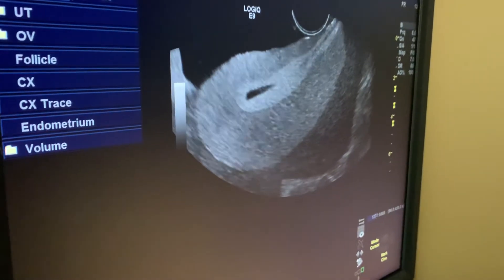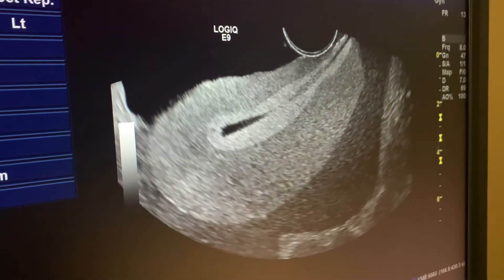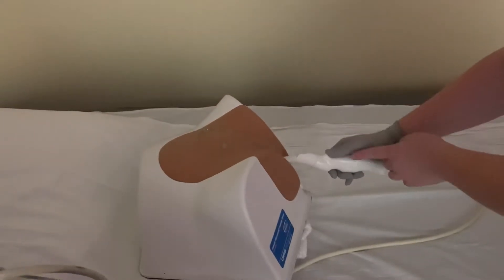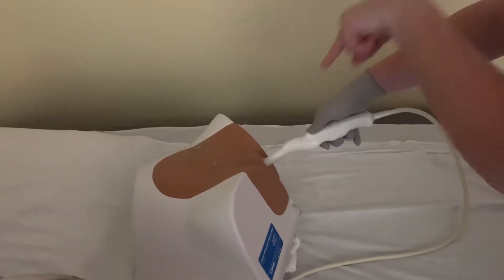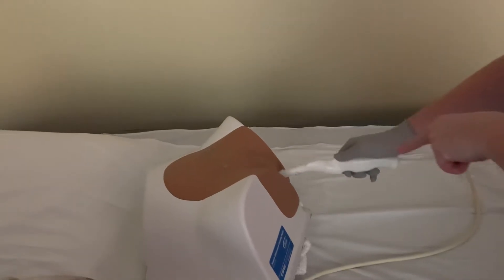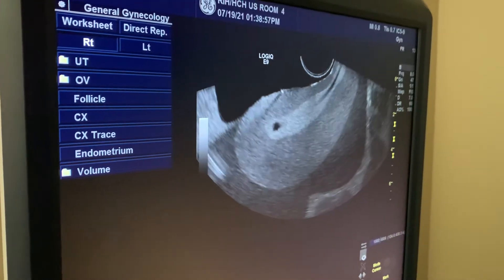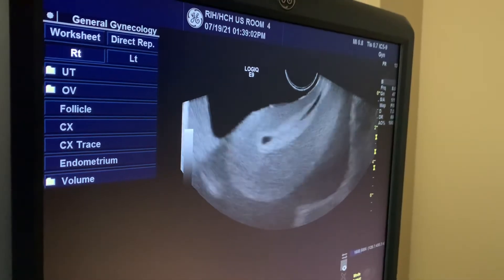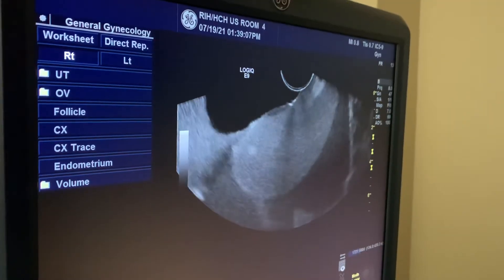Now looking at the screen with the probe in sagittal — just like the transabdominal probe — if I angle the probe up, that means I'm pushing the handle down while the top of the probe goes up. If I lift the handle, the probe itself goes down. That's the seesaw maneuver. Angling the probe upwards takes us to the fundus; angling down takes us towards the cervix.